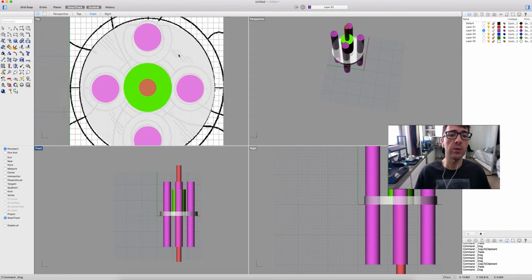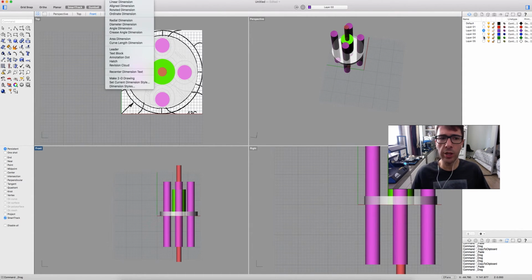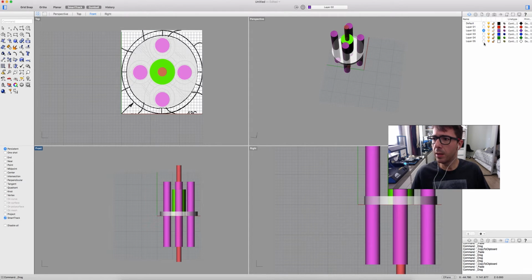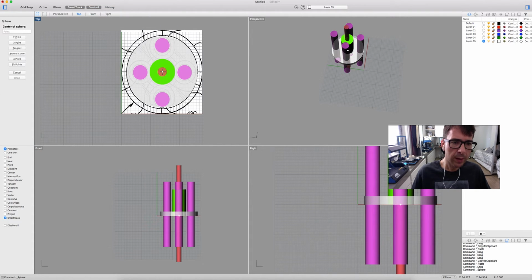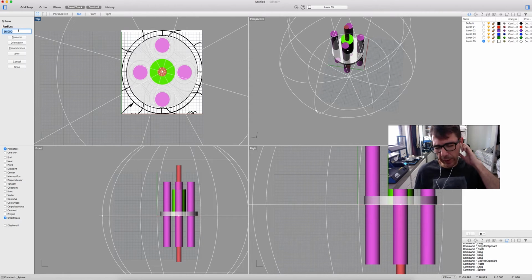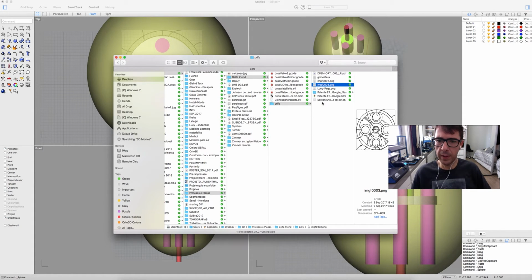Now we just need to create our glenosphere. We are choosing a 38 glenosphere. Let's change color again. Let's choose this, solid. Now we're going to select a sphere, solid sphere, the central pin guide here. And now we can draw the sphere just like that, or we can choose the radius. The radius of the glenosphere is 30, just let me check. I have forgotten.